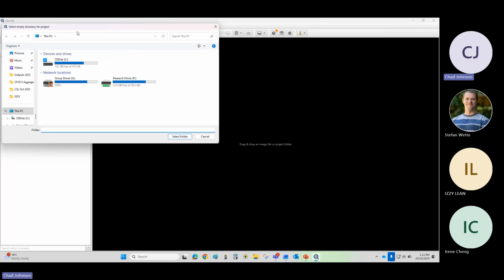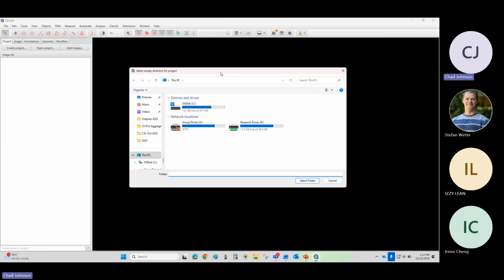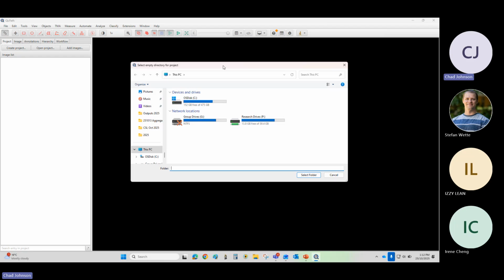So what we're going to do is go create project. When I attend these workshops, not as a presenter, I typically just watch. You're more than welcome to work along with me, but I'm usually a watch and then do the things later. It depends how good you are at multitasking.